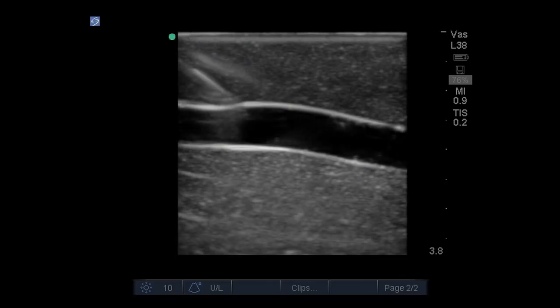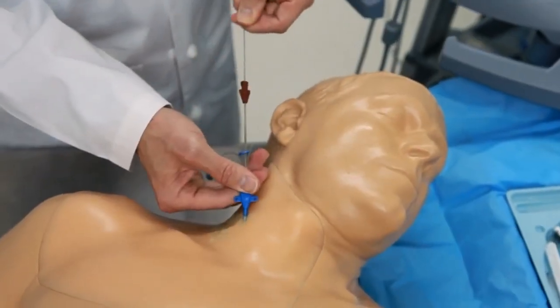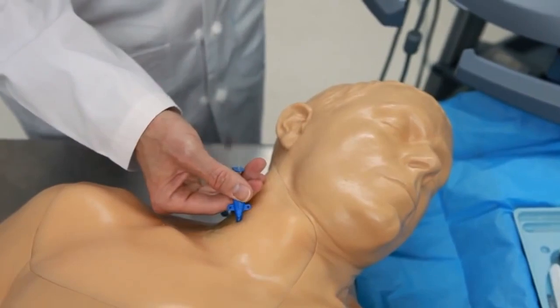With its self-healing tissue, it can withstand tremendous use, minimizing the need for replacement parts. CAE BluePhantom's Ultrasound Central Line Mannequin is durable and realistic for all your training needs.